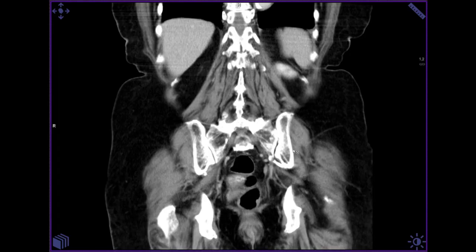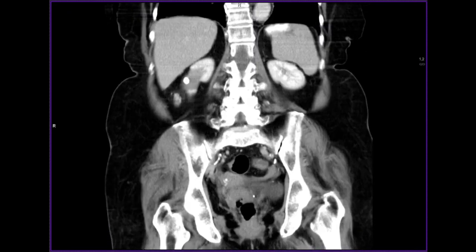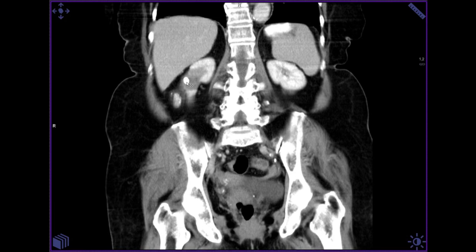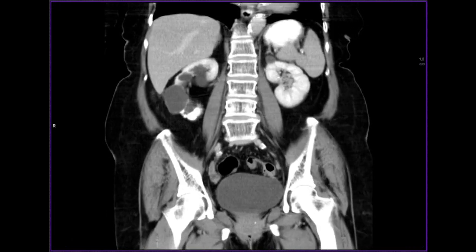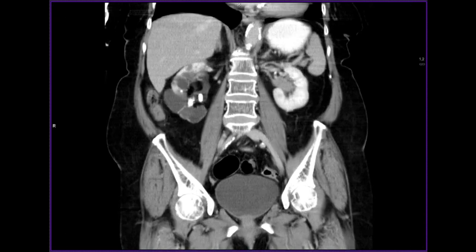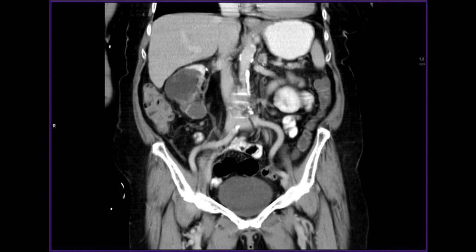CT abdomen scan. During an abdominal CT scan, a technologist will capture images of the organs of the digestive tract, such as the intestines, colon, liver, spleen, and appendix. A doctor might order an abdomen scan to detect abscesses in the area, to discover internal bleeding, or to identify and diagnose tumors such as those in the colon.